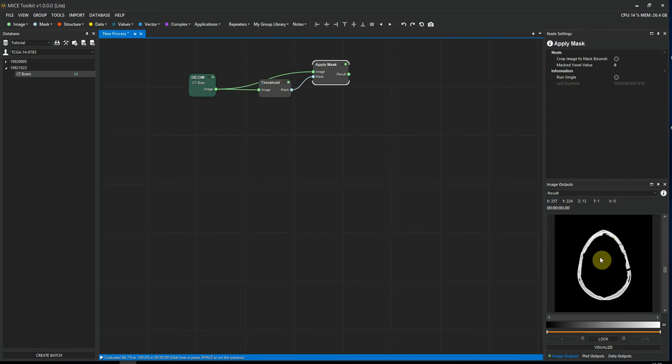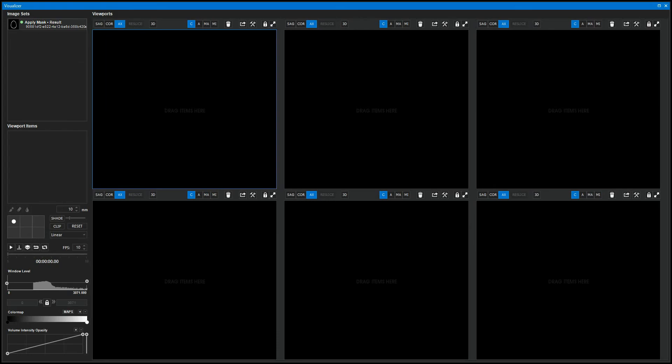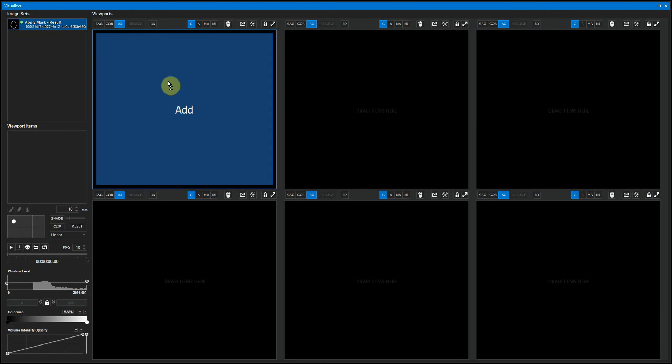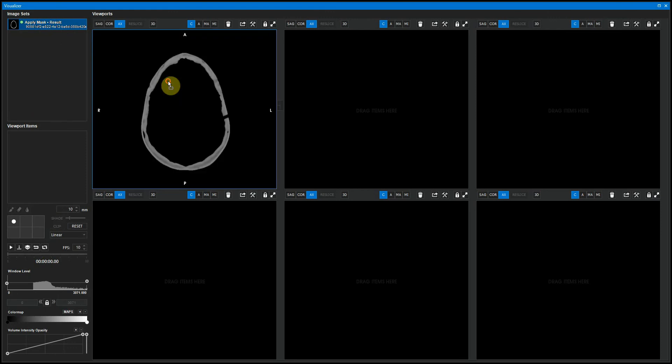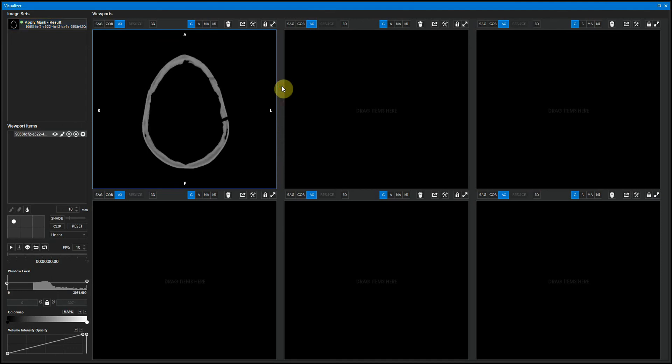Now let's send this to the visualizer, which is a more advanced viewer than the one we have here. So I'm going to click visualize to take us to the visualizer. This is the visualizer. All images that are sent to the visualizer end up in the image sets panel in the upper left. To view an image, simply drag and drop from this panel onto any of the available viewports. You can use the scroll wheel to scroll up and down in the slices, or you can use a slider on the right.